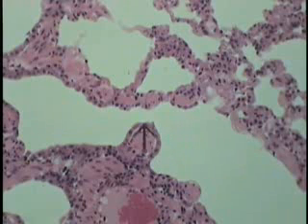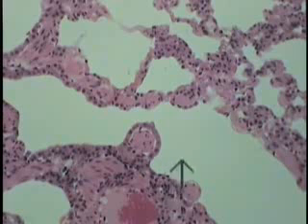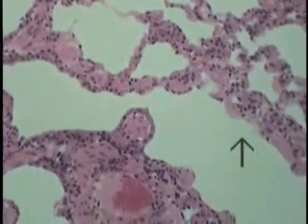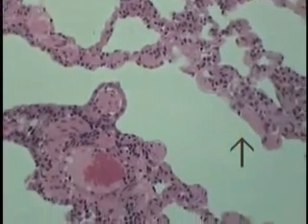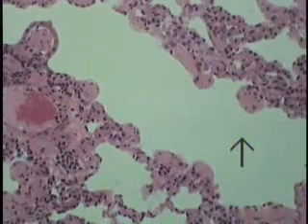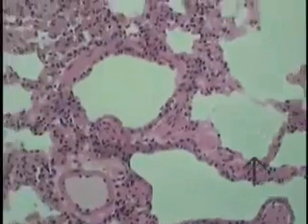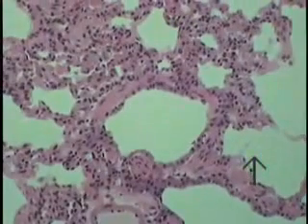As you can see, there are cuboidal type cells here. Here you can see it's very, very thin and thinned out, so these are probably type 1 alveolocytes, a very thin, flattened, squamous type of epithelial cell. And this is that short transitionary period where the lumen will become continuous with an alveolar duct, which we'll examine shortly. Let's go back and examine some of these points at increased magnification so the details can be observed.